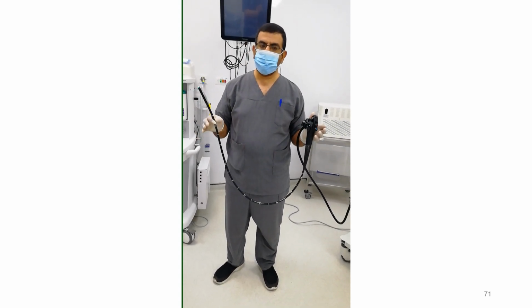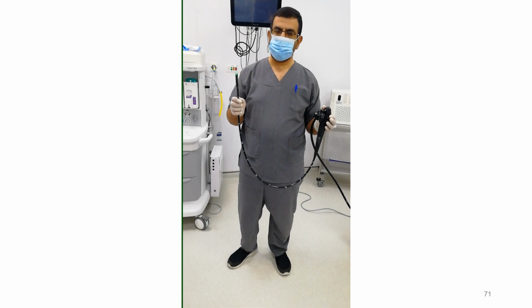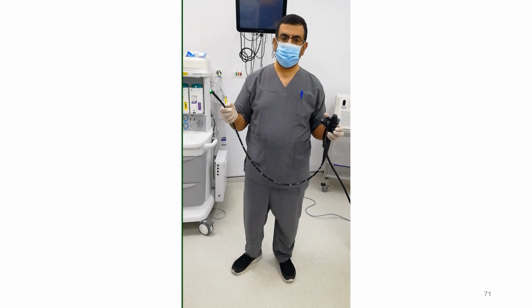طيب إحنا كده عرفنا الحركات المهمة عن طريق الأبر إندوسكوب، وعرفنا إزاي بنجيب ريتروفليكشن واستخداماته، وإزاي أقوي الريتروفليكشن بتاعتي، وعرفنا البول والبوش، وعرفنا إزاي أجيب رايت وليفت.